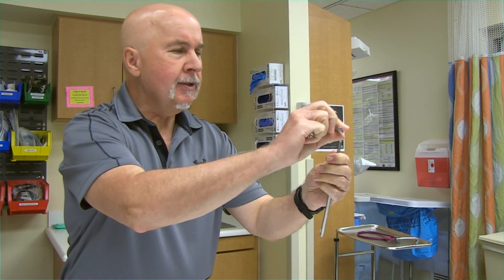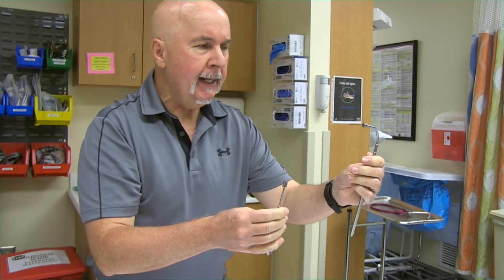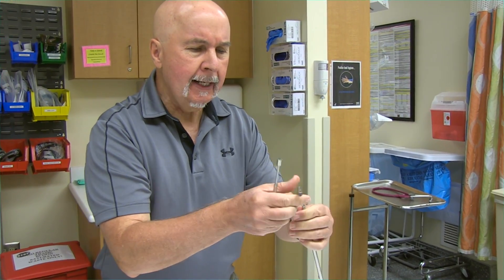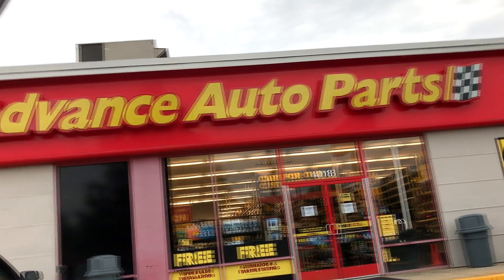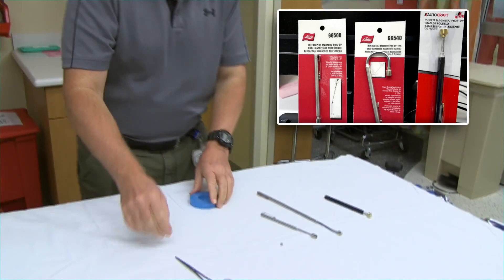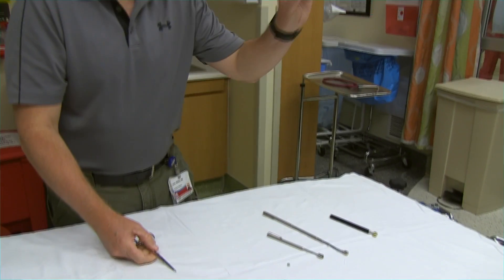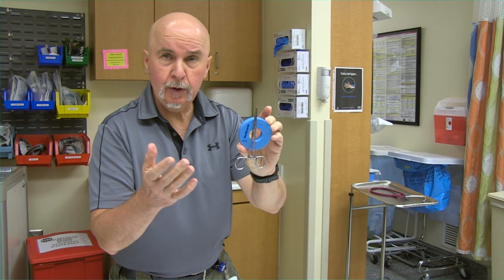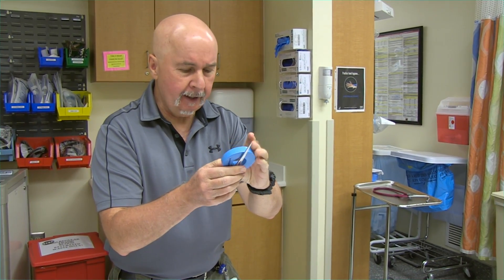This tool is on a flexible tip — this magnet. They're rare earth magnets, actually pretty powerful little magnets, and you can get these at any auto parts store. If you don't have those, I would recommend getting them, but you can basically get your pacer magnet and magnetize either a screwdriver or something that will fit into an ear canal.